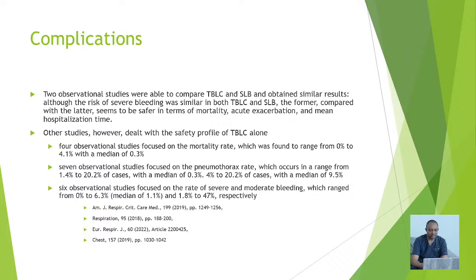So please talk to your patient so that they understand, although those risks can happen, we are prepared to deal with it. The other risk that occurs is pneumothorax, and that is why whenever we are doing these procedures, we are ready to fix a chest tube.